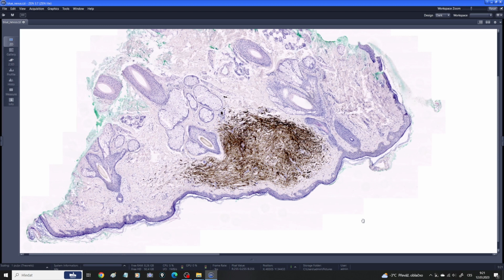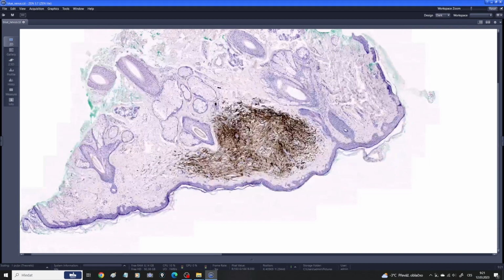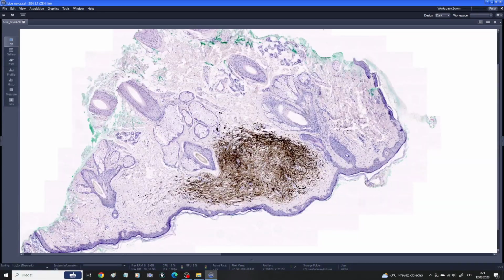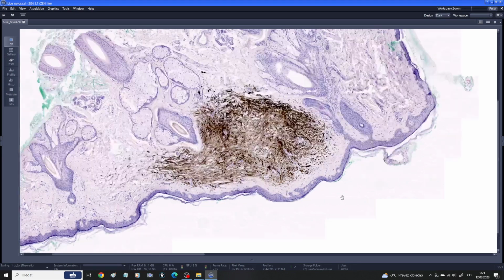And why is it blue? It's blue because usually the tumor is situated much deeper in the dermis compared to other subtypes of nevi. This is not the best example, to be honest, because in this example the lesion is situated quite superficially, but very often it's situated much deeper. And that's why the lesion is grossly blue and not black or brown.